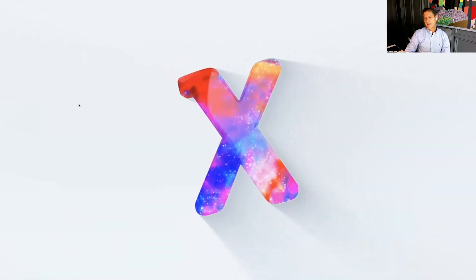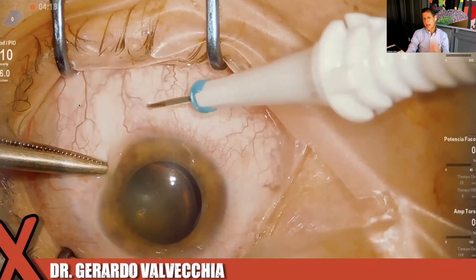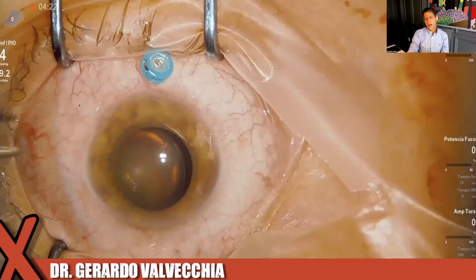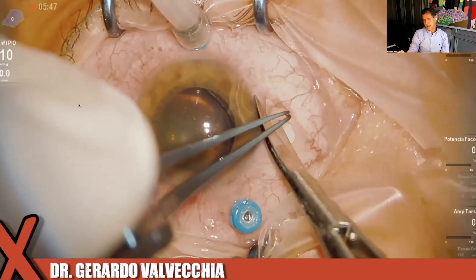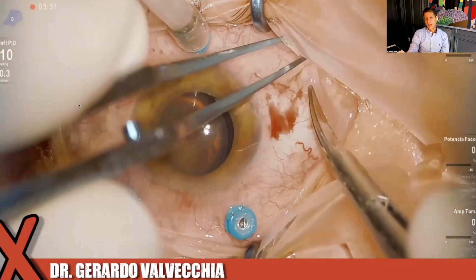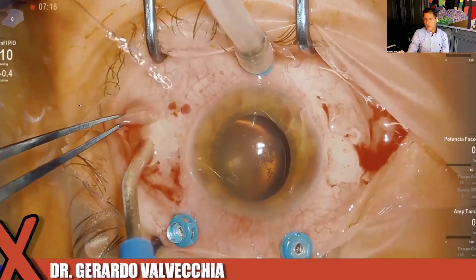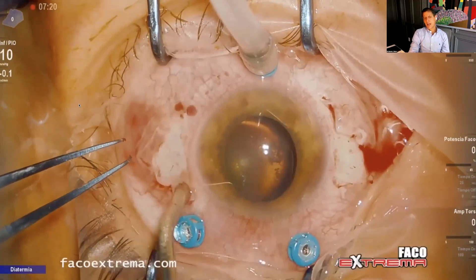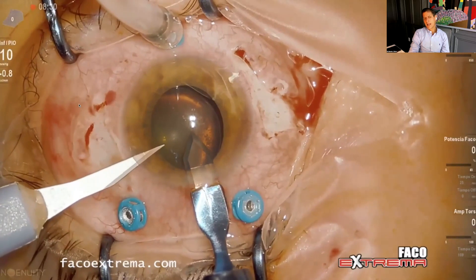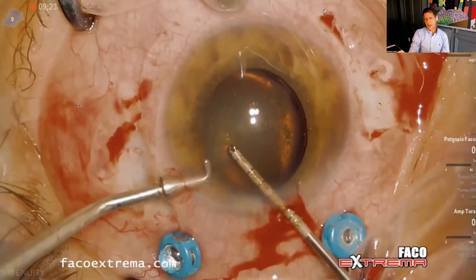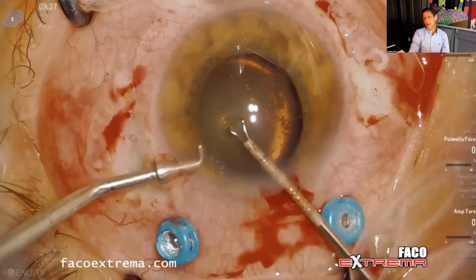Lastly, I'll show the Yamane technique, which I don't use very often. I've tried it four or five times and find it more difficult than it appears — the lens tends to have more tilt and less centering precision than what I achieve with the Agarwal glued IOL technique. This video was shared by a good friend, Gerardo Vendecchia, who uses it frequently. If you feel comfortable with it, go ahead — but my personal experience is that it is tougher than it seems.